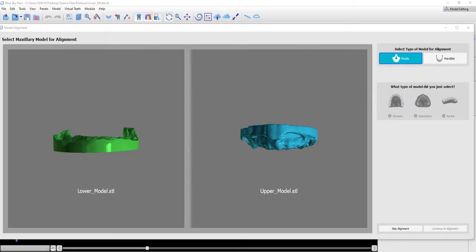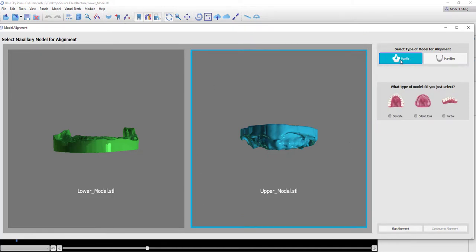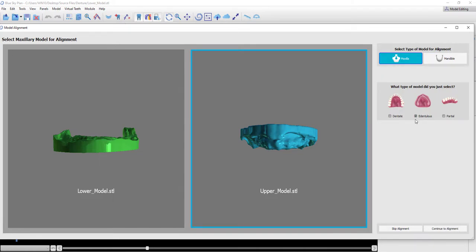The software automatically opens the model alignment functionality displaying in front of us the models that we have selected as well as the model file names. Simply left-click on one of the models, select the draw type, and then select the type of model. In this situation, we're going to be selecting Edentulous. Continue to alignment.